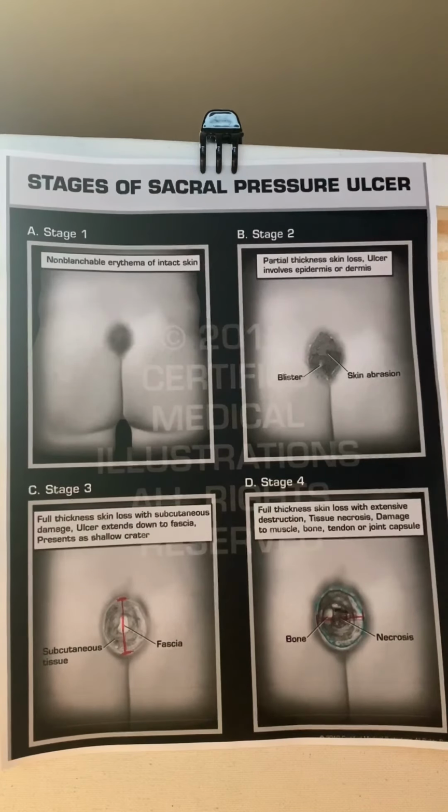That's the inconsistency that we have right now: one nurse can interpret the wound starting at one area, or one nurse has a different method of measuring a wound than another. This digital one offers consistency across the board, so they can measure the wounds the same throughout each person.